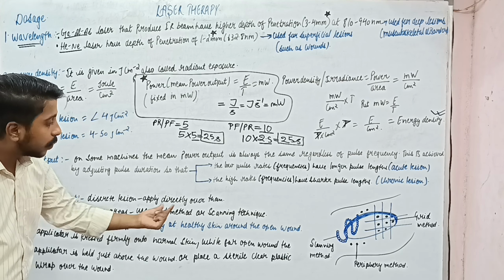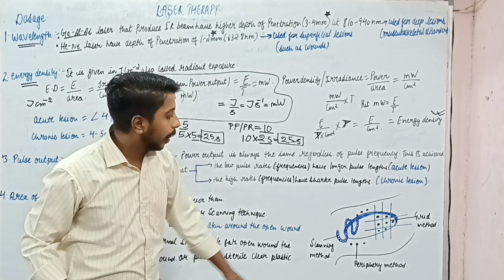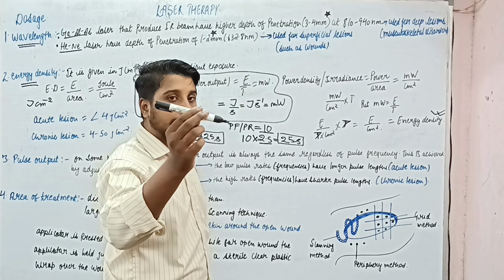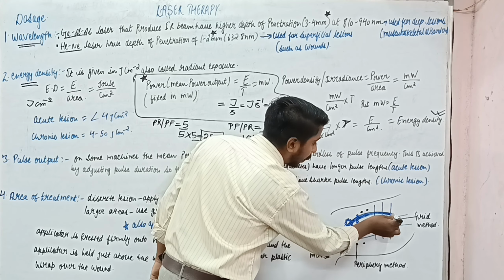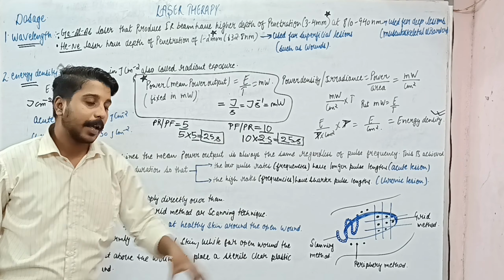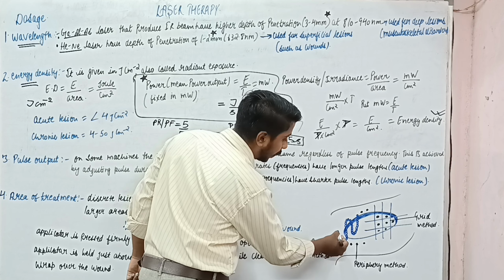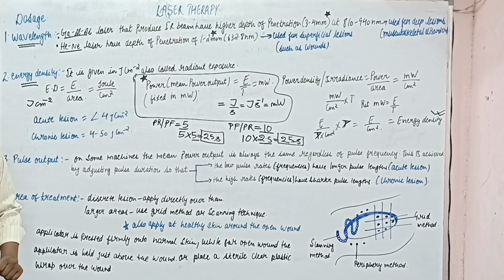For larger area, we use the grid method. Let us say this is an area where we want to apply laser. Okay, so we will divide this area into grids. Grids are smaller parts, and we will apply. Let us say this is the pen of laser. Okay, it is emitting laser. I will apply it here, then sometime after here, then here, and then here. So we are giving laser to each and every grid. Okay, for larger area we use grid method or scanning technique. This is the scanning technique. Once here, then down, then down, then down. So like this. Okay, so it is the scanning method.